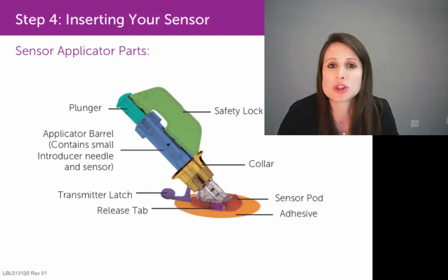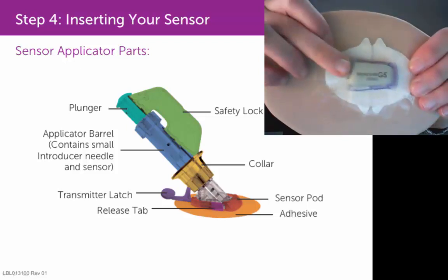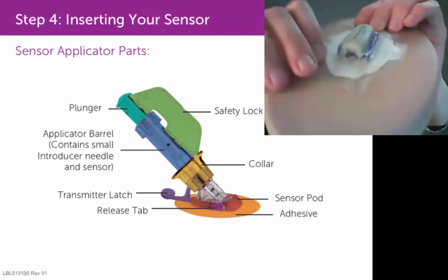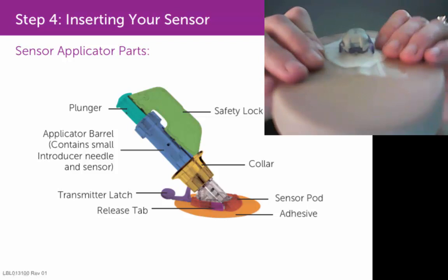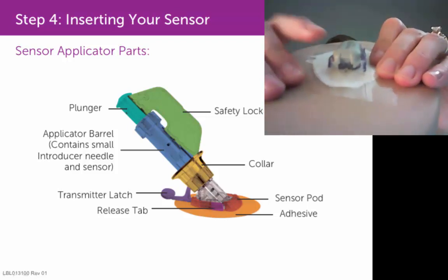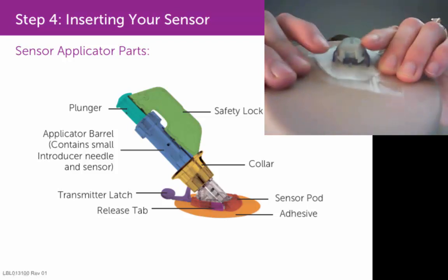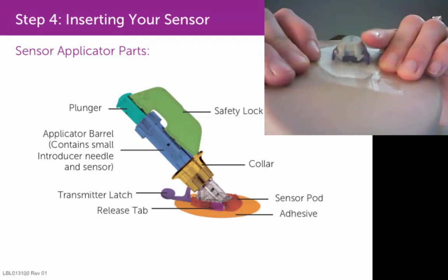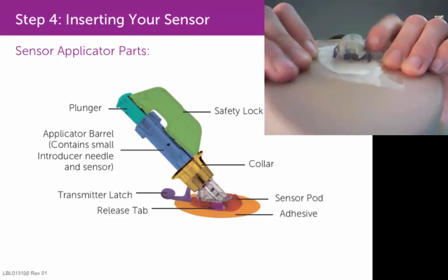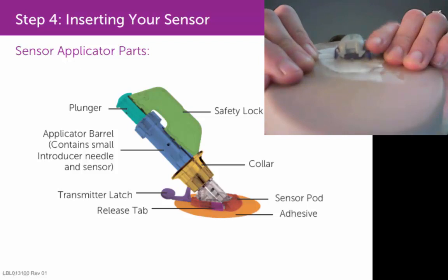Let me show you what it would look like if you only heard one click when pulling on that transmitter latch. If you looked at the D-for-Dexcom end of your transmitter, you would see that one side was not snapped down — and it's very subtle. You would see that one side of the transmitter is clicked in, and this side is not. That little gray triangular piece is sticking up above that plastic wing or prong of the sensor pod.